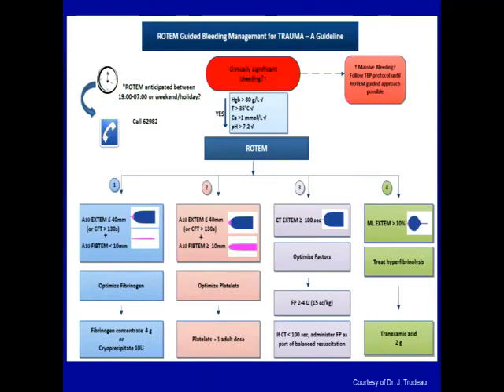In trauma, I don't see it on this protocol, but oftentimes we can have a patient that we're resuscitating for 30, 60, 90, 120 minutes, depending on how rapidly they're bleeding, whether it's a surgical issue or not. If there's a surgical issue, when the OR is ready, we try and get them up as quick as possible, but we're then resuscitating in the OR as well. Are there any guidelines on how often you should be repeating the ROTEM test to guide your ongoing resuscitation?